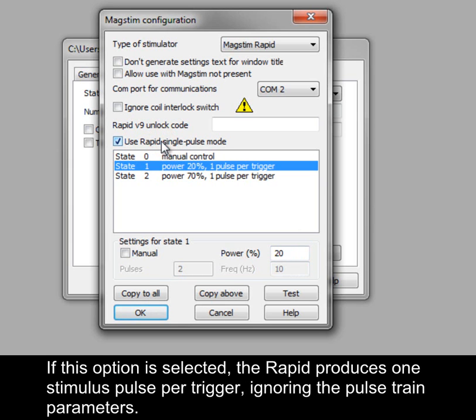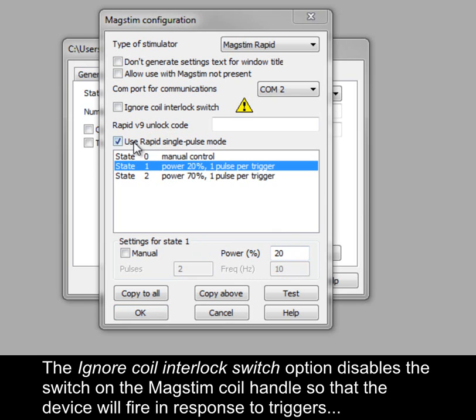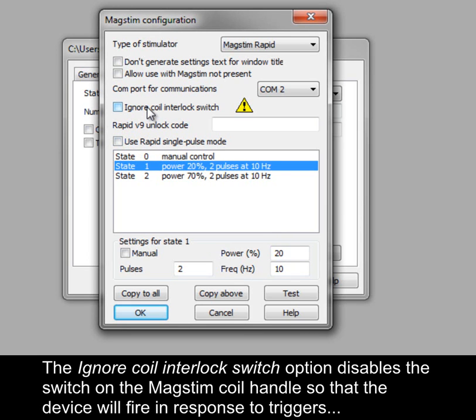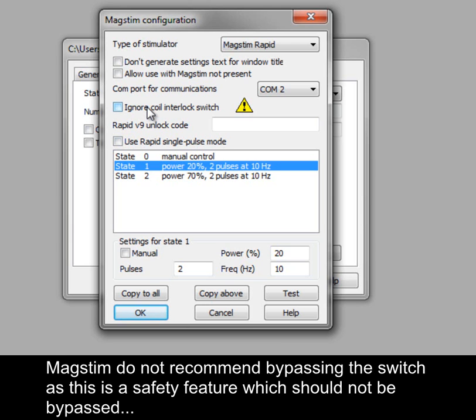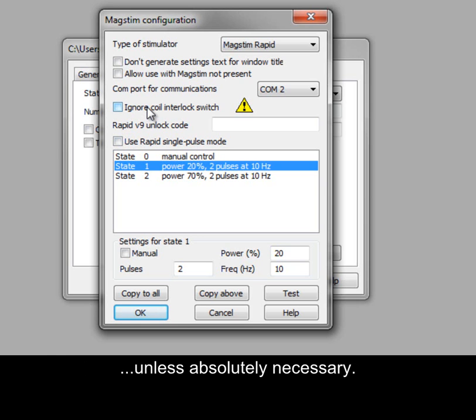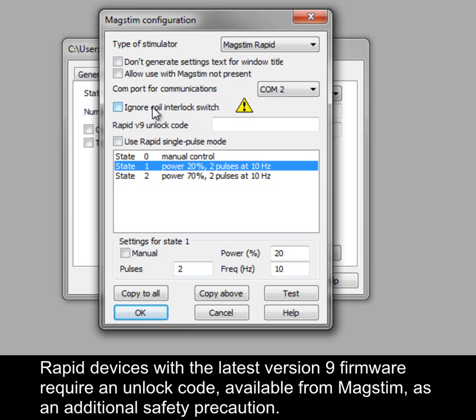If Single Pulse Mode is selected, the Rapid produces one stimulus pulse per trigger, ignoring the pulse train parameters. The Ignore Coil Interlock Switch option disables the switch on the MagStim coil handle so that the device will fire in response to triggers without the button being depressed. MagStim do not recommend bypassing the switch as this is a safety feature which should not be bypassed unless absolutely necessary. Rapid devices with the latest version 9 firmware require an unlock code available from MagStim as an additional safety precaution.